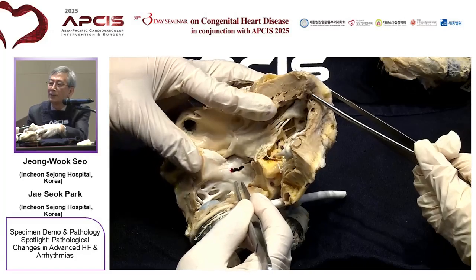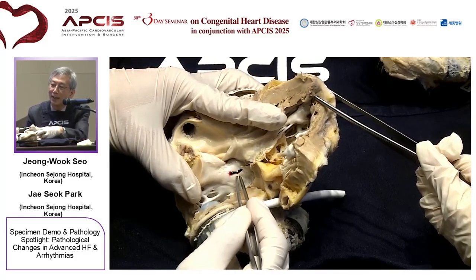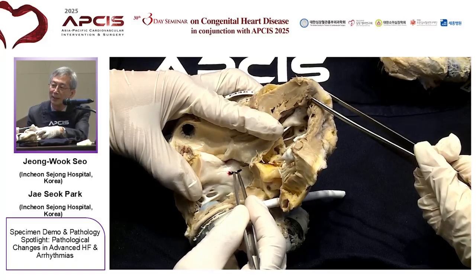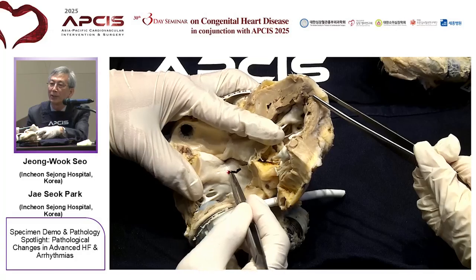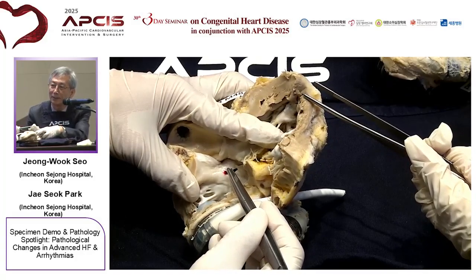So in this case, conduction system pacing was tried, but not sufficient. The reason was, one is the massive fibrosis of this area due to myocarditis, and the second is the too shallow approach of the CSP lead in this patient.